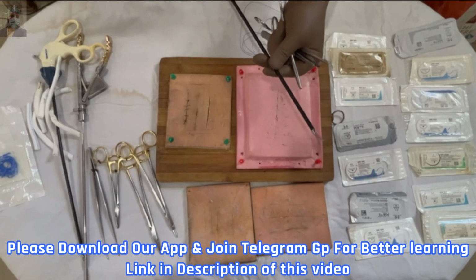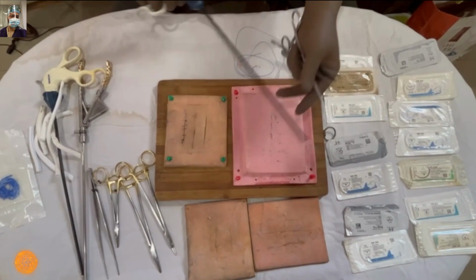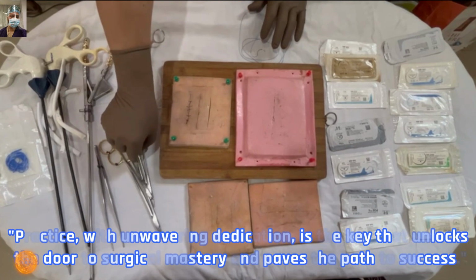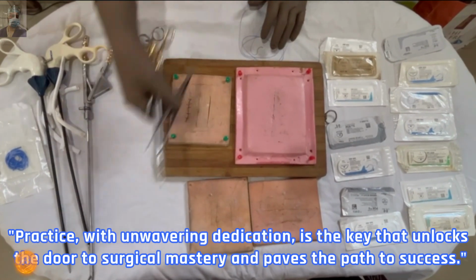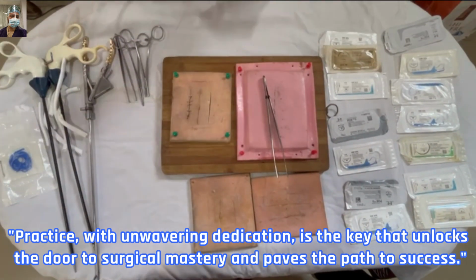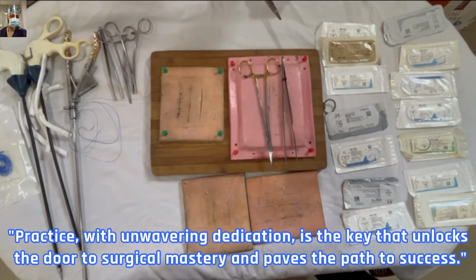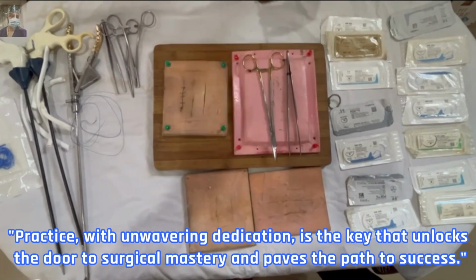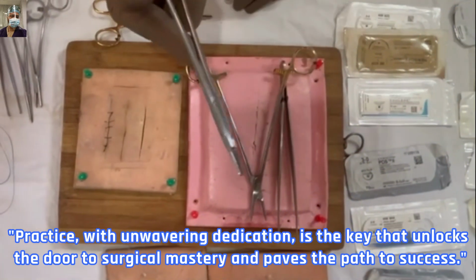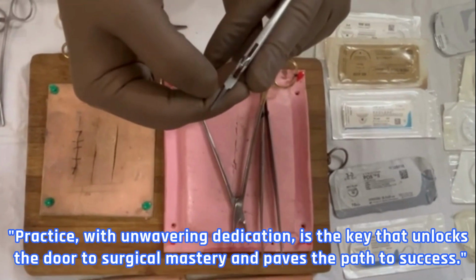Then again, as you move higher and as you progress in your surgical career, then you can purchase your own, better instruments, these golden handle instruments like this good needle holder, this long needle holder, and a Ryder needle holder. But I prefer to use my own instrument. This is basically a long needle holder, friends, and this is a Ryder. The Ryder is a vascular type of needle holder used for 4-0, 5-0, 6-0 needles for fine suturing.